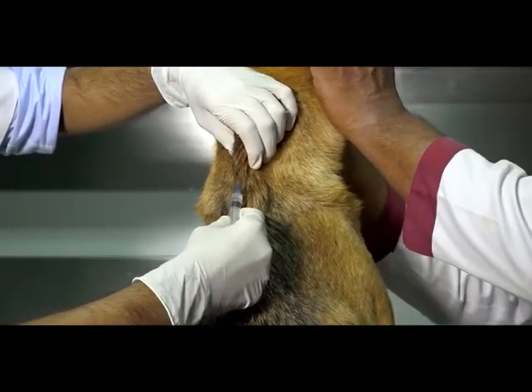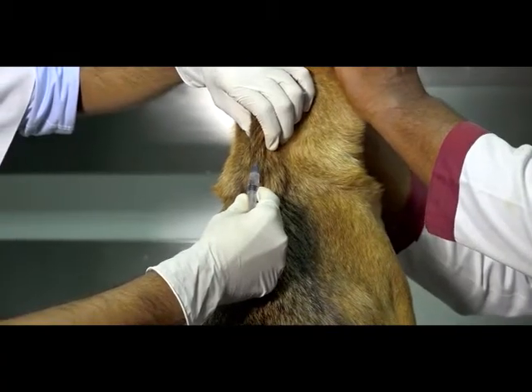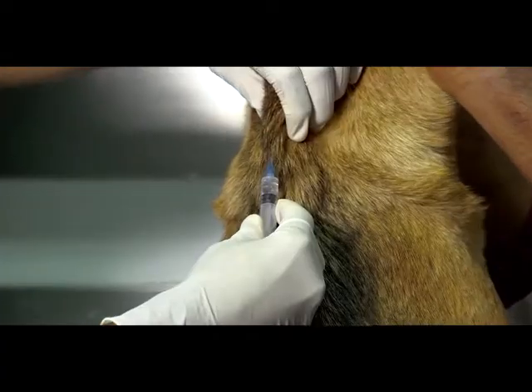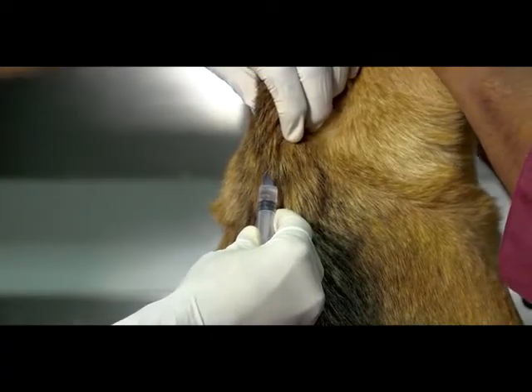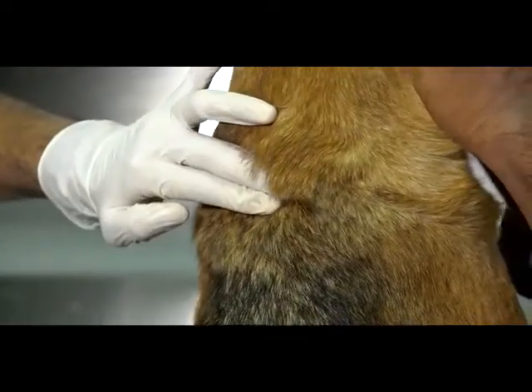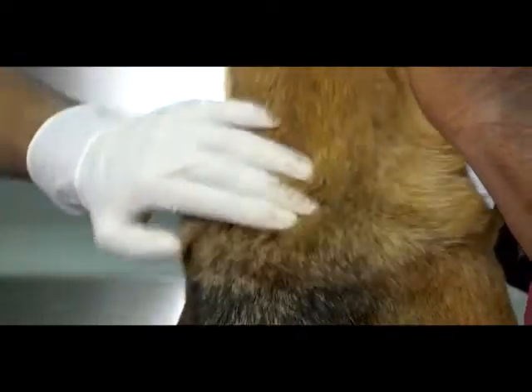You pull the plunger back to see whether there's any blood, and then gently inject the drug. You can take it out, then give a good rub so the drug is properly absorbed.